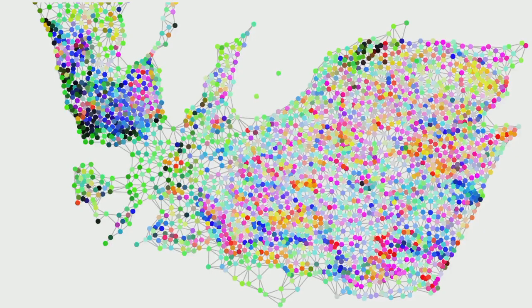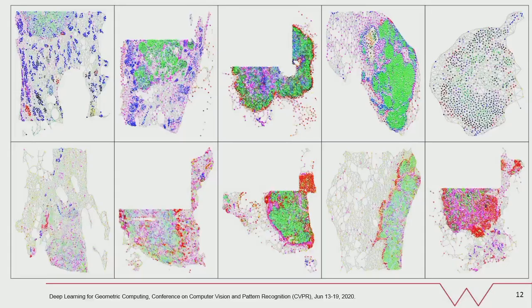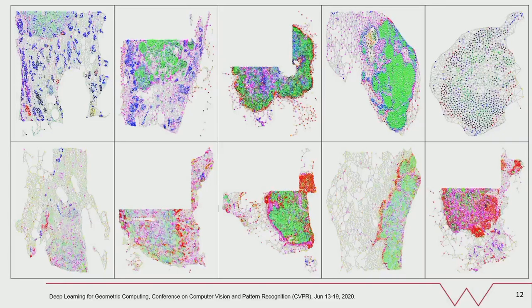Here you can see a whole slide level graph, or slide graph, with false coloring over nodes representative of their nuclear composition. As you can see, this modeling approach enables us to identify different types of cellular communities — clusters in different groups — which enables receptor prediction downstream. Here is another slide graph. We found that slide graph allows good visual discrimination between positive and negative cases by showing different components or tissue regions that are active in different types of receptor positive or negative cases.